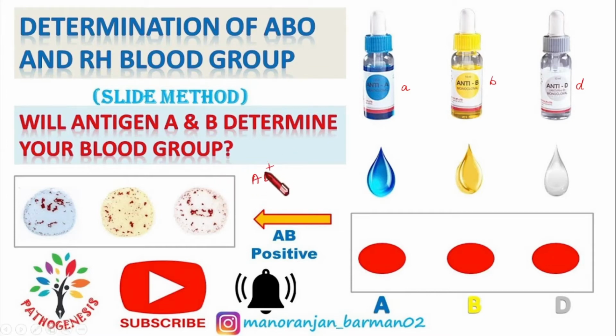AB positive. So, as we add antisera A to the first drop, we know that both antigens A and B are present here. And by adding this, which antibody is coming here? A antibody. So, it can interact with this antigen and will result in agglutination. Then think about the next case, while adding antisera B. Antisera B contains the antibody B, so it will interact with the B antigen and result in agglutination.